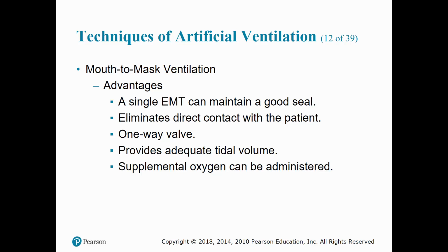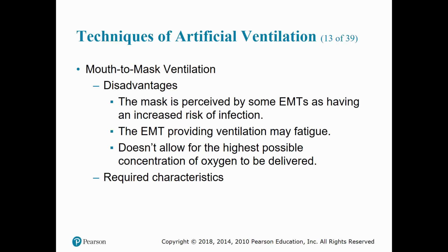However, where anything has advantages, they also do have disadvantages, such as the mask does make a perception by some EMTs as having an increased risk of infection. The EMT providing the ventilation may also fatigue after a period of time, especially if they're having to do CPR at the same time. The device, however, also does not allow for the highest possible concentration of oxygen to be delivered with each ventilation.